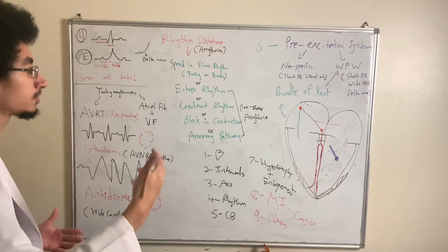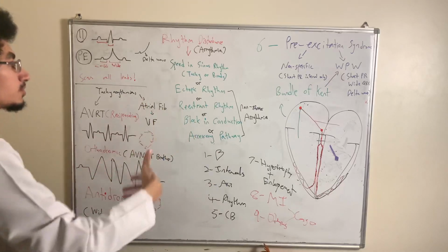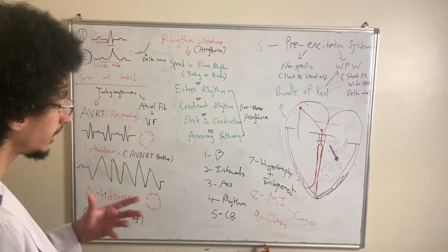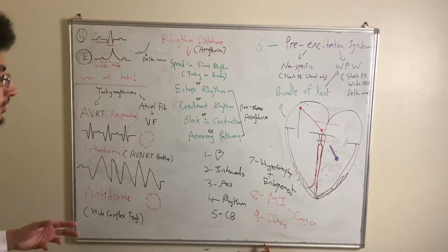But in general, people just refer to it as Wolff-Parkinson-White. You want to complete the term with symptoms, Wolff-Parkinson-White syndrome, with the EKG changes plus the symptoms, palpitation and shortness of breath, okay? Okay, now, what is the problem with pre-excitation syndrome?